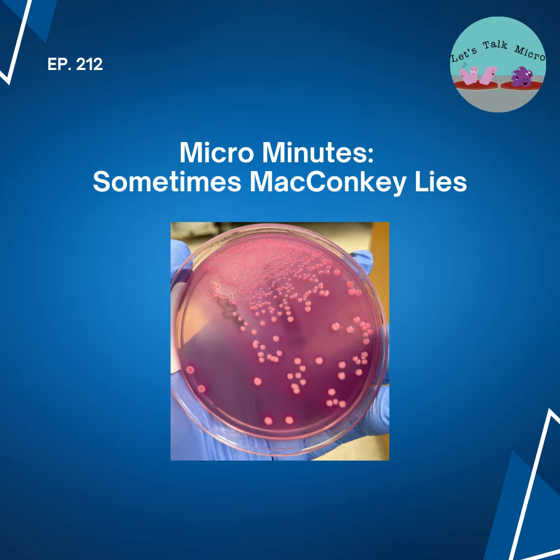It's not a diagnostic tool. It is a tool that is used to help you recover your organisms and help you a little bit in the identification and recovery. As I said, it can help separate your lactose fermenters from your non-lactose fermenters, but it cannot confirm the organism identity. Of course, it doesn't determine a gram reaction. So your MacConkey result must be interpreted with the gram stain, specimen type, and the whole clinical picture.